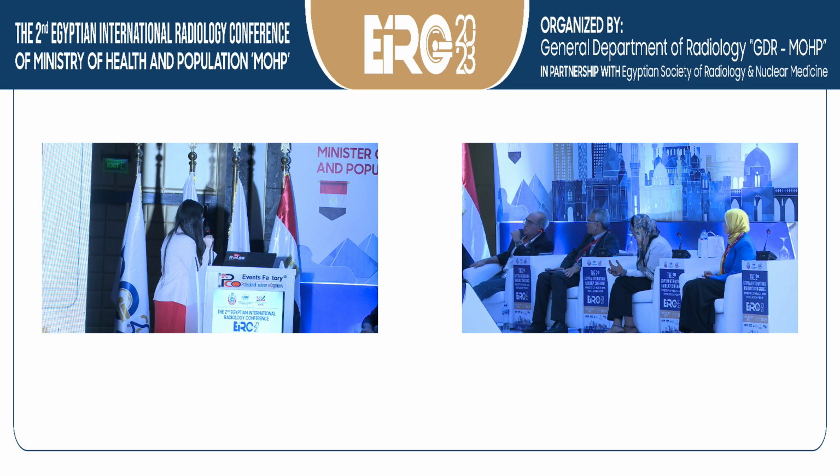Yes, sir. So I have one case to share, if you allow me. There was a patient who was very young, alcoholic definitely, and was going for a liver transplant, around 32 years old. When they used this technology, the numbers were coming in as insignificant fibrosis, around 1.6, which doesn't show that it's cirrhotic, but definitely the liver was very shrunken, with irregular borders, ascites, everything. The features show it's cirrhotic.